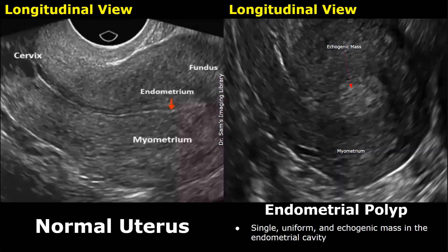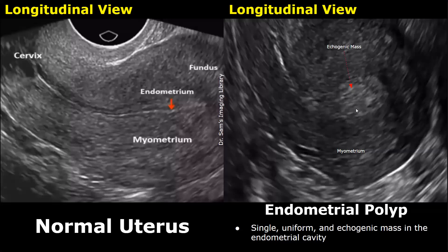The image on the left is of a normal uterus — this is a transvaginal image in longitudinal plane — and the image on the right is of a polyp. A polyp can appear as a single homogeneous hyperechoic mass in the endometrial cavity.